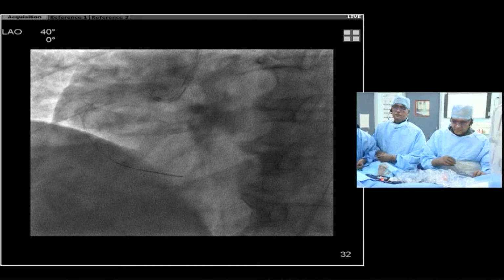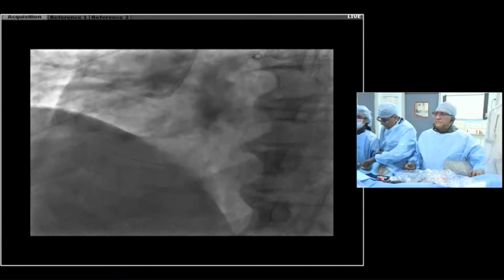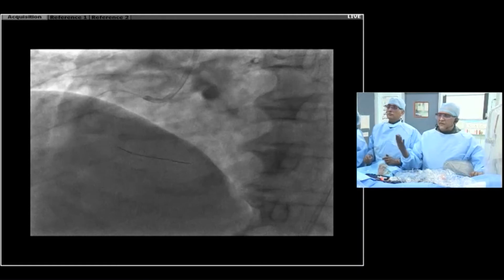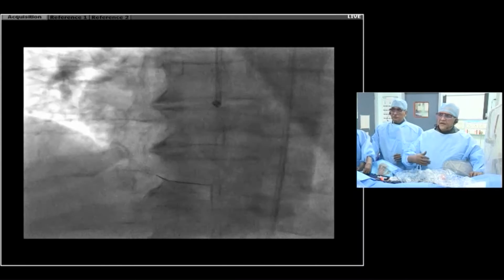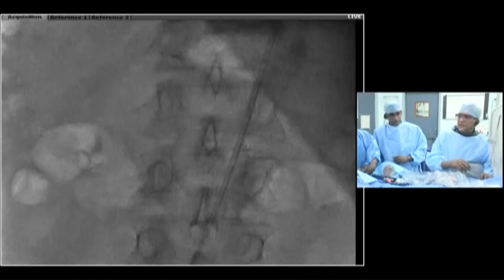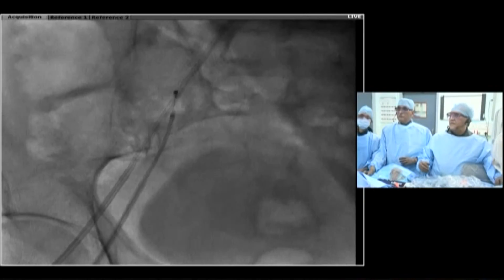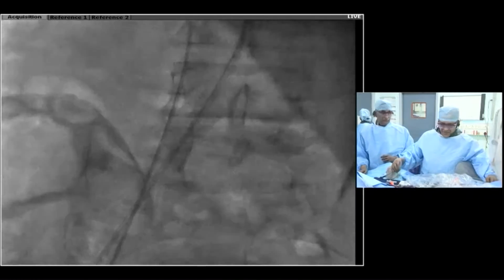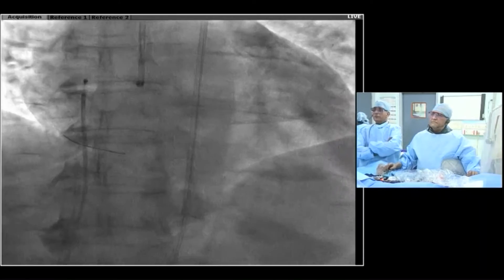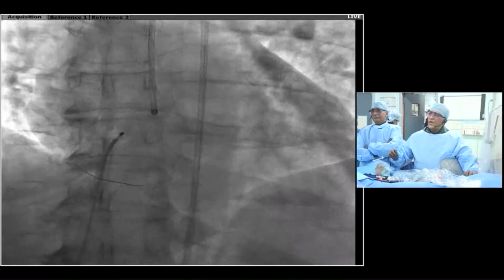Kirti, while you set up, are you set up to go? We'll stay with you real quick, and then we'll go back and come back. Typically it takes me 2 minutes to set up, but please feel free to go back and we can show you later. We can show you rotational atherectomy in this artery or in the circ, wherever you choose. Yeah, why don't we do that. We'll love to see your technique for the circumflex. That would be good. I think you're wise in putting the pacemaker in because you're going to be doing both the right and likely the circ as well. There are many people who say they never use it, but this is a reasonable case to do it. So let's go back and then we'll come back.